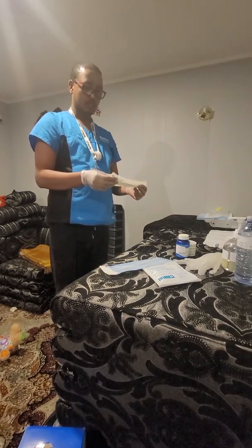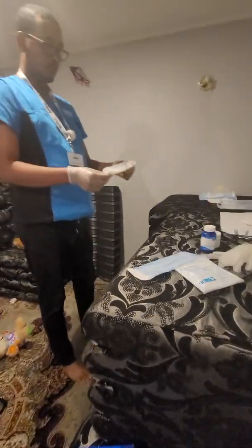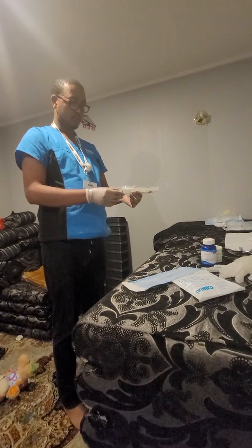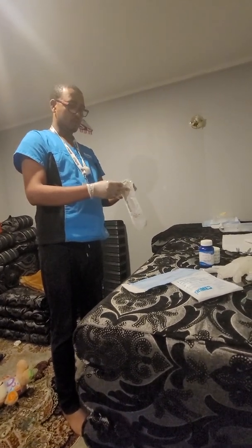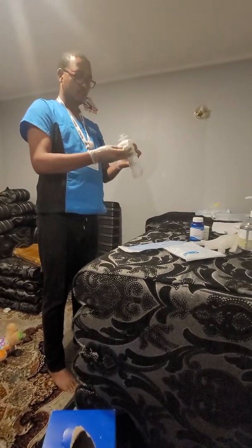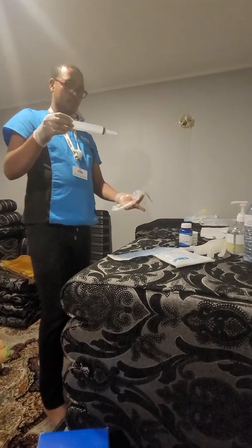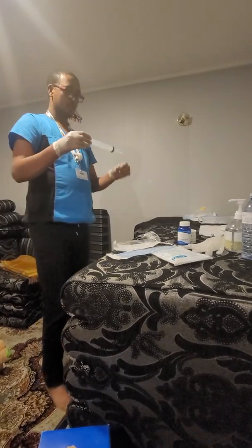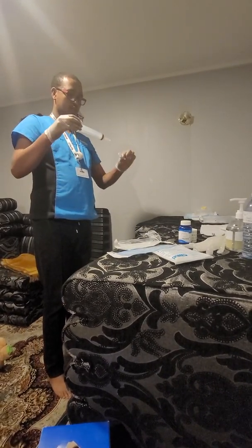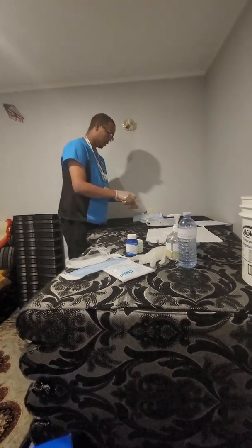Ideally I have to use 30 to 50 ml with a 19 gauge angiocatheter, but for now I'm going to use this one, because this does not have a Luer-Lok. So I'm gonna put it this way, down, keep the sterility of the tip, remove the tip, and then pour it.